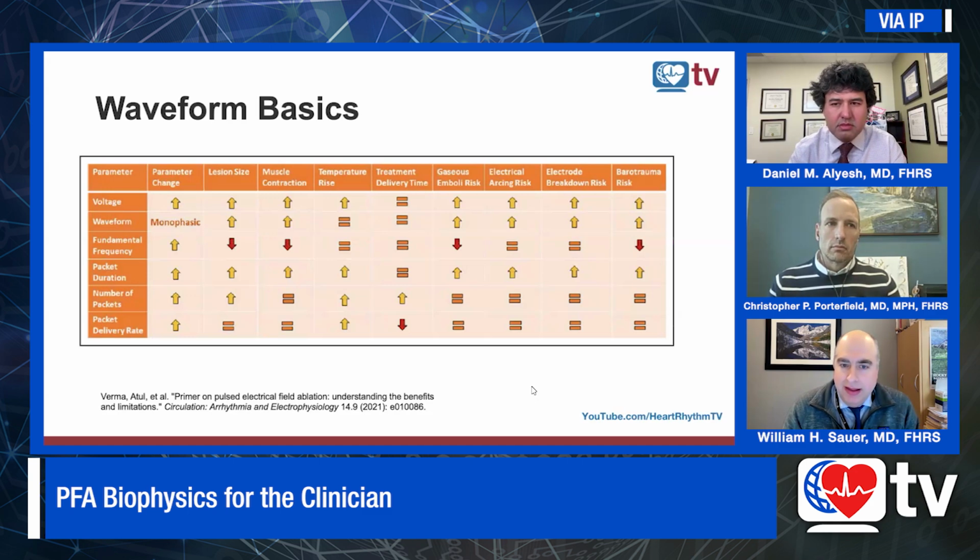I guess what I would say is that a lot of preclinical studies went into developing the waveform, the voltage, the frequency, packet duration. And if you looked at some of the original clinical papers, there really was a difference in pulmonary vein reconnection and pulmonary vein isolation. So it's not voodoo. There really is something to the science there. And so that's why we're handed this tool that has already had the preclinical evidence to guide us.